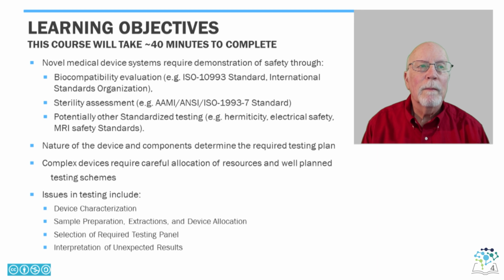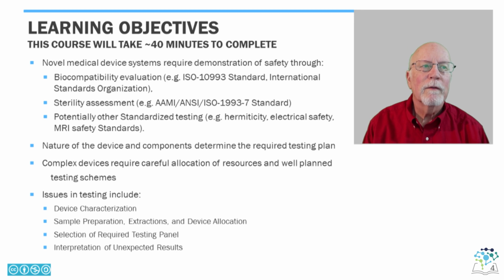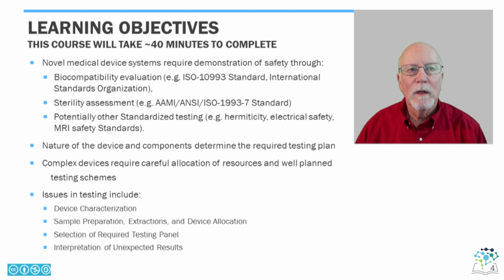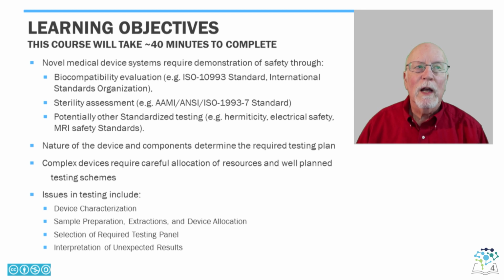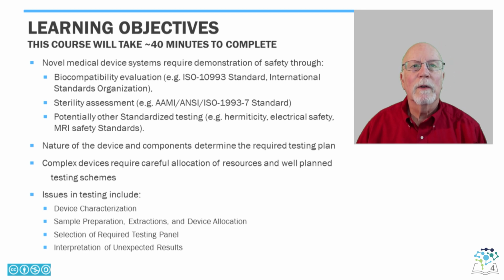We'll discover that complex devices require the creation and optimization of well-planned testing schemes along with careful allocation of resources. Through examples, we'll review device characterization, sample preparation, extractions, device allocation, selection of required testing panels, and finally some hints on interpretation of unexpected results.